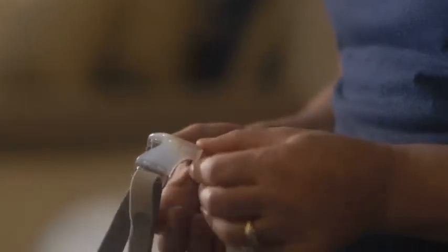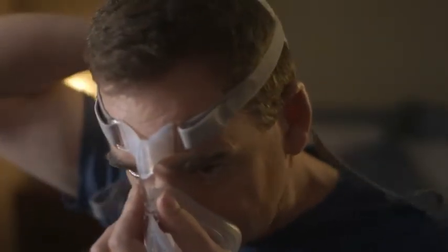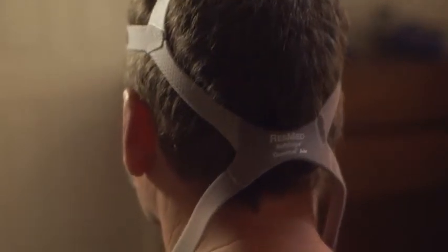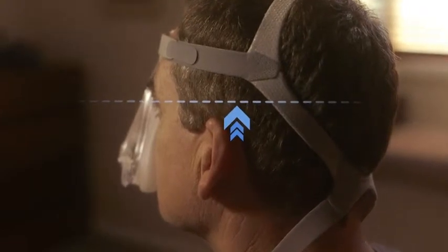First, make sure that the top straps of the headgear are loose and that both of the lower headgear tabs are not attached. Then, hold the mask in place like this. Now pull the top headgear over your head, making sure it's the right way round. The top headgear straps should sit just above the ears, over your hair.